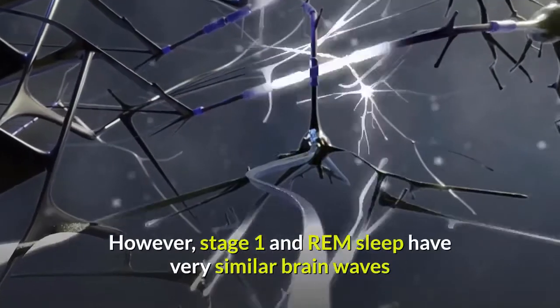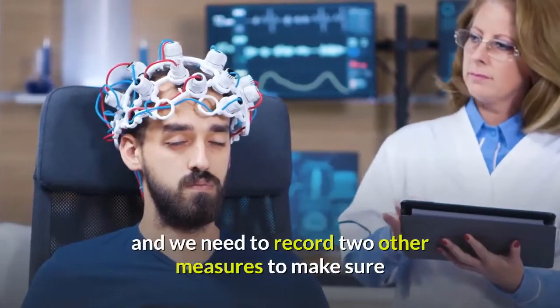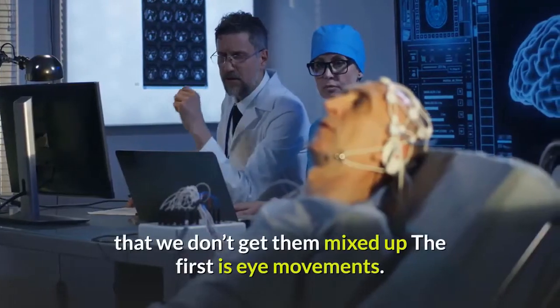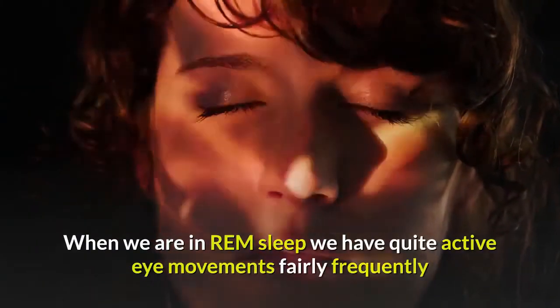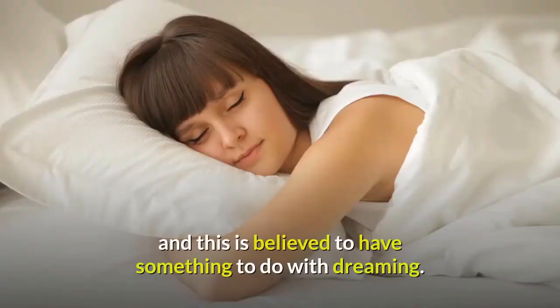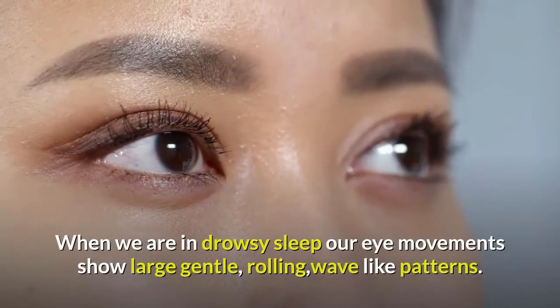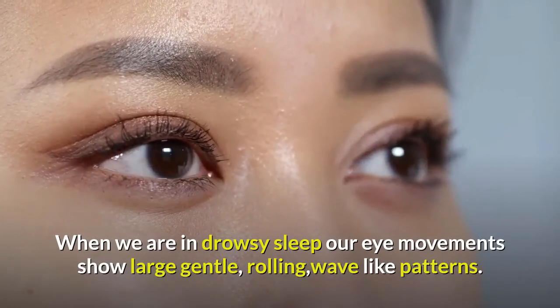However, Stage 1 and REM sleep have very similar brain waves, and we need to record 2 other measures to make sure that we don't get them mixed up. The first is eye movements. When we are in REM sleep we have quite active eye movements fairly frequently, and this is believed to have something to do with dreaming. When we are in drowsy sleep our eye movements show large gentle, rolling, wave-like patterns.